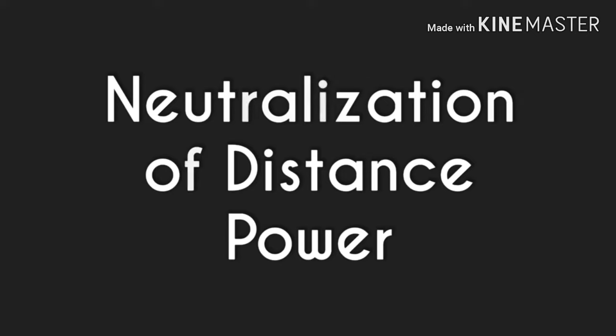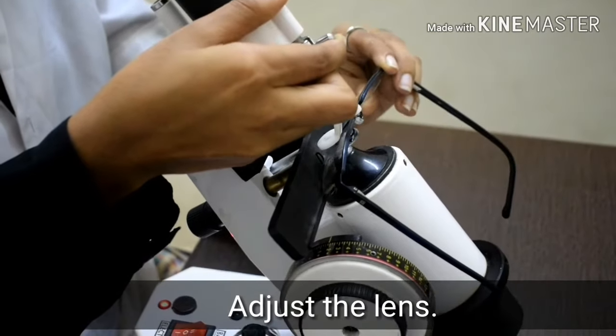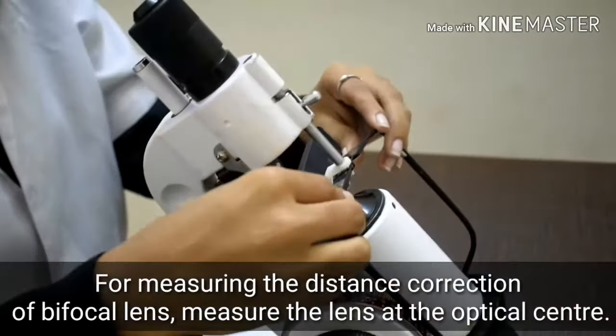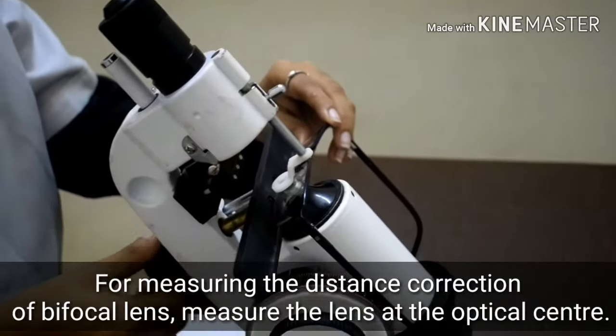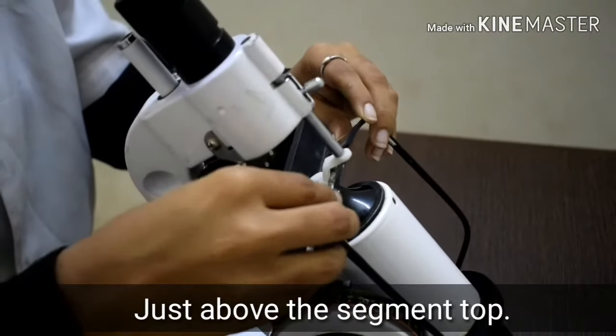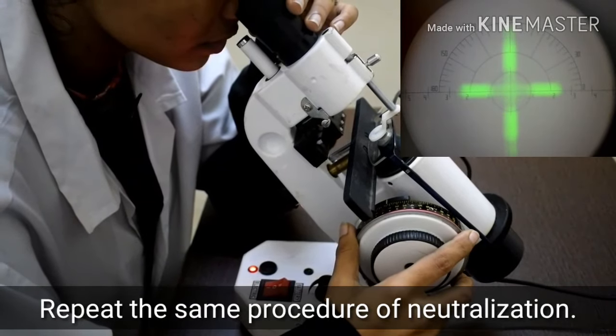Neutralization of distance power: adjust the lens. For measuring the distance correction of a bifocal lens, measure the lens at the optical center, just above the segment top. Repeat the same procedure of neutralization and note the reading.